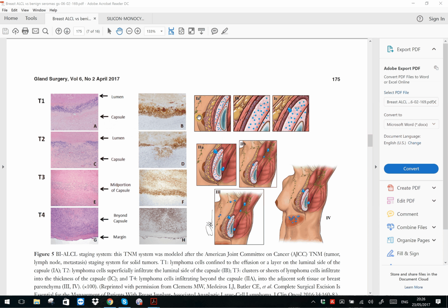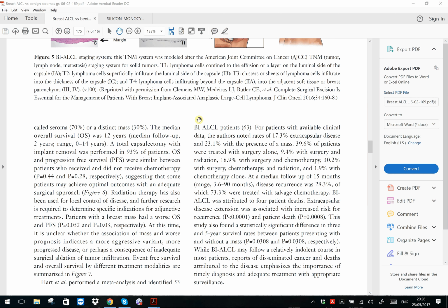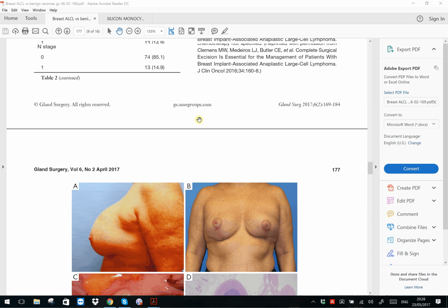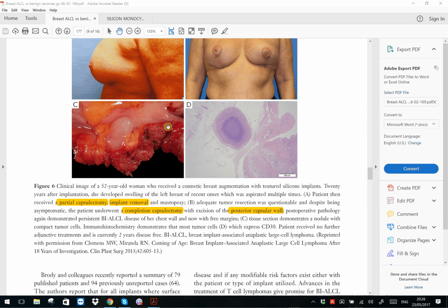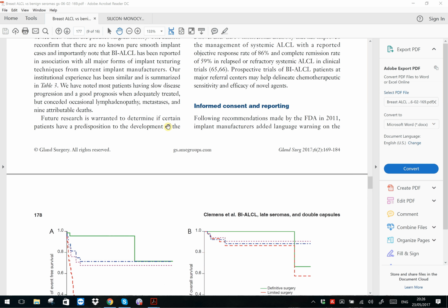But why in this case should we consider the monocyte, macrophage, dendritic cell as the cell present in the effusion? Is this reactive? Is this an inflammatory cell? How should we proceed?